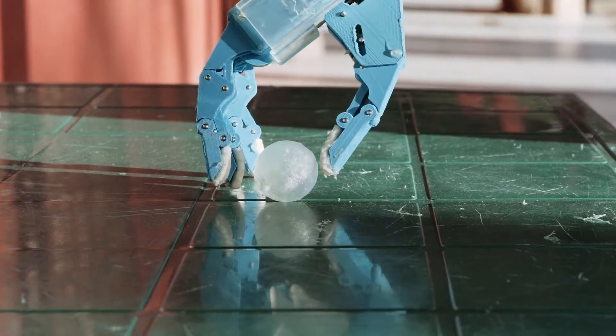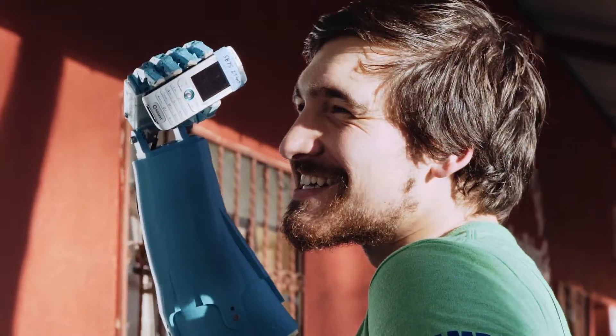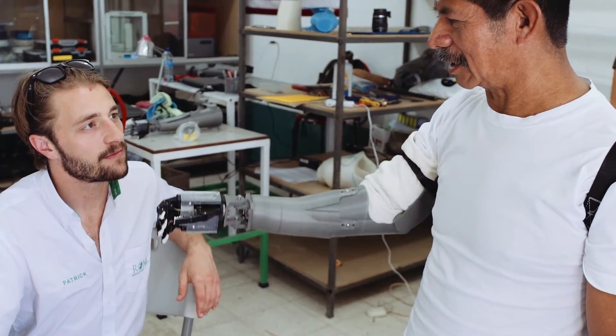Now Josh, you mentioned this is made out of plastic — how much would the material cost be to put this together? That's a great thing: the material cost is almost negligible. For the entire device, material cost with bolts, plastic, everything, you're looking at about 70 to 75 dollars. That's amazing — it's really, really cheap.